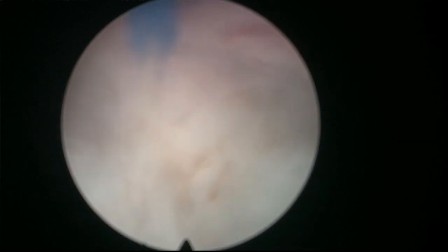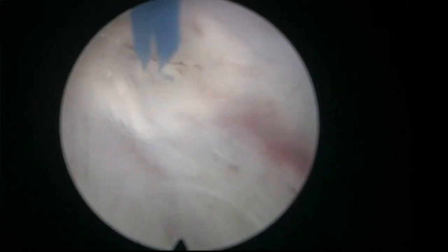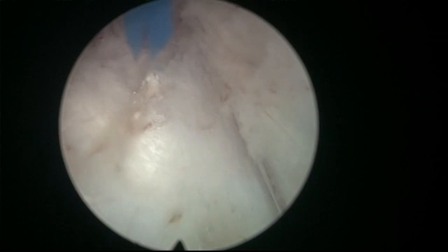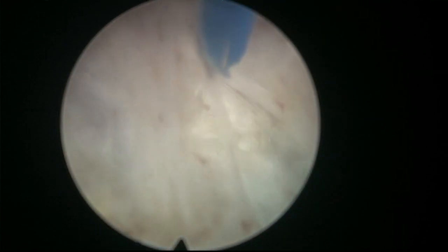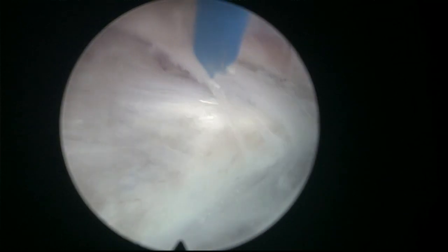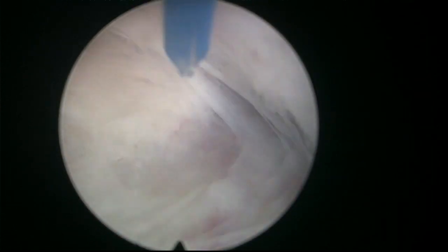And here, you have to be constantly playing with the fiber distance and the angle of incidence. Where do you fire? If you fire against the line of attack or closer to the adenoma, you have to play with these tissue effects, targeting practice to get exactly what you want. You have to change your strategy during the operation. It's a very concentrated activity where you have to be absolutely focused on what you're doing.